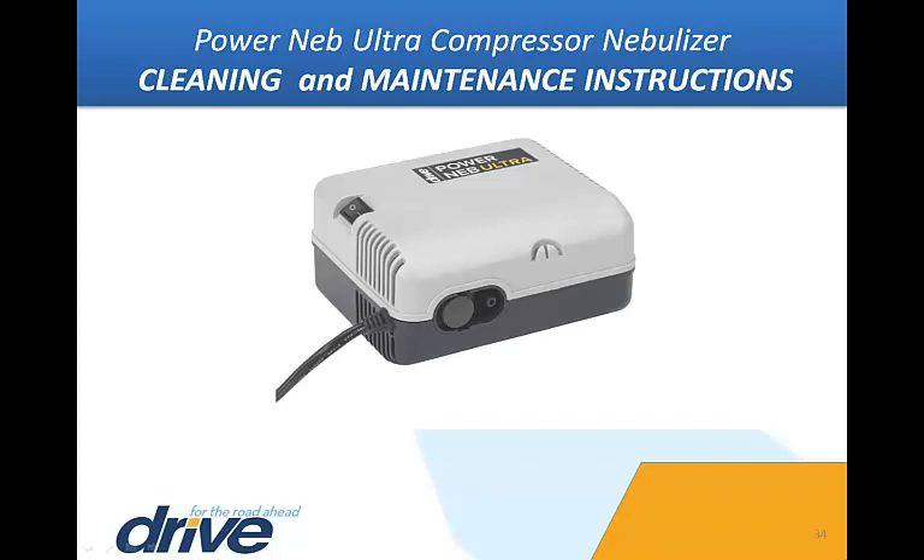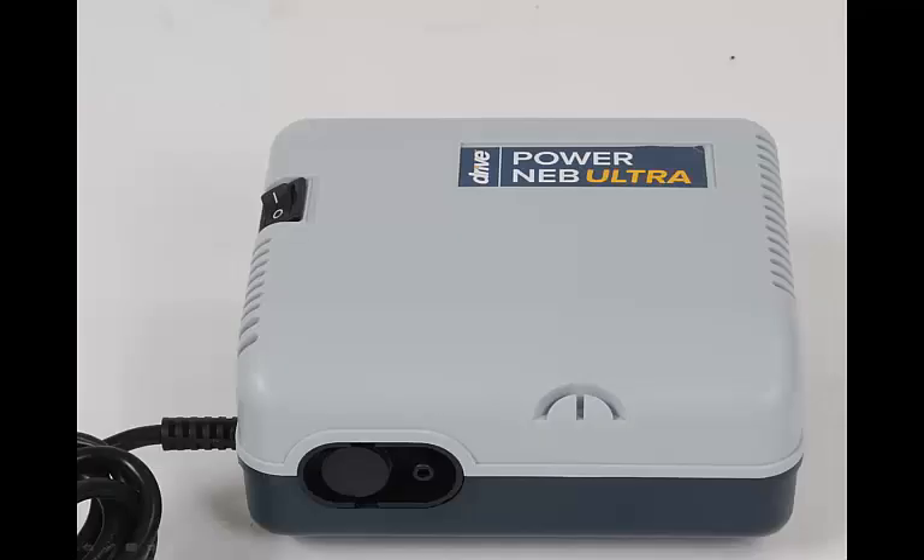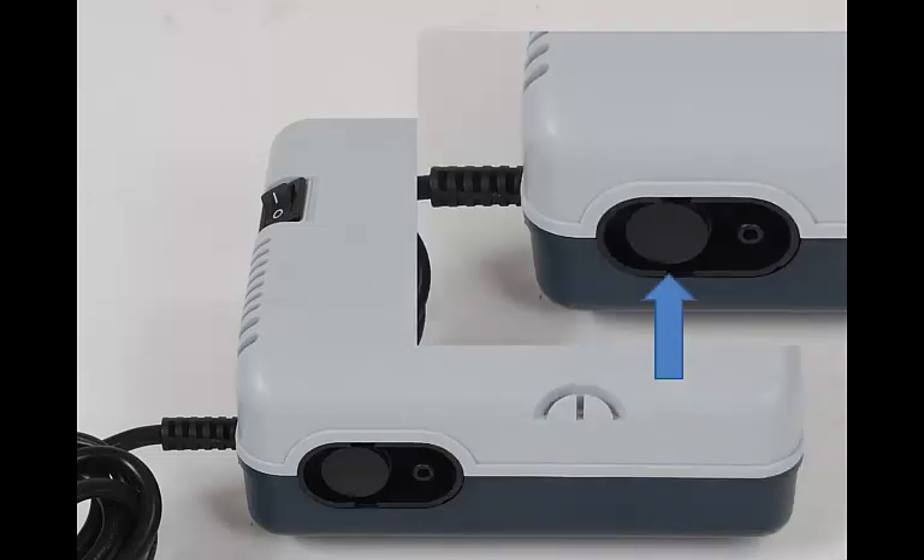Keep the outer surface of the PowerNeb Ultra Compressor clean and dust free. Always be sure the power is switched off and the unit is unplugged before cleaning. With a damp cloth, wipe the outside of the compressor case every few days. To keep your PowerNeb Ultra operating at peak performance, the filter should be changed every six months, sooner if the filter discolors. Remove the filter by grasping the filter cover firmly and pulling away from the unit. Discard the old filter, replace with a new filter, and push it into position.